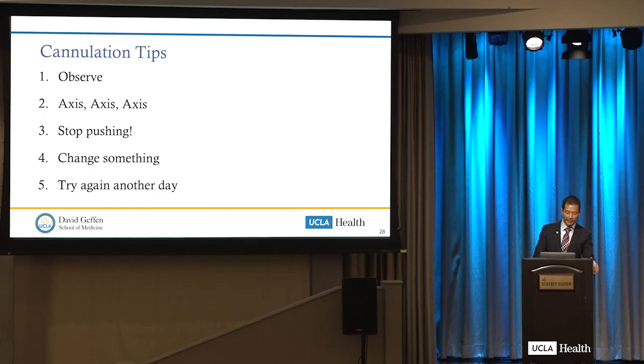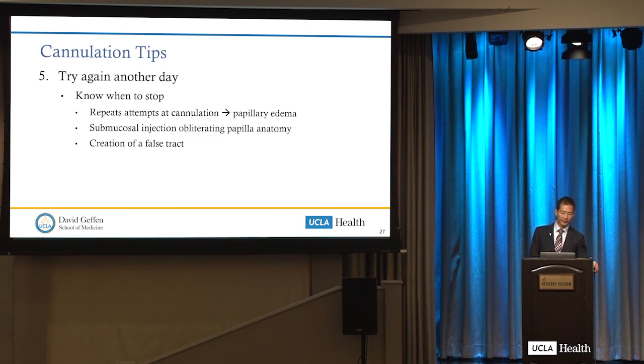And then try again another day, right? I think we have a lot of pride. We don't want to fail ERCP. You want to come out of the procedure and tell the patient, the family member, we didn't get into the bile duct, but it's something to consider. All right, so know when to stop. Again, that's rule number 5.